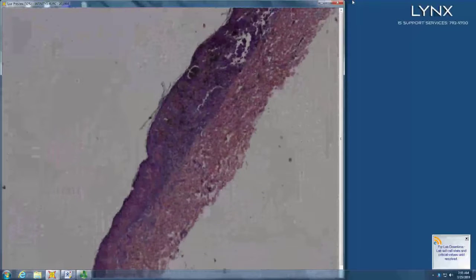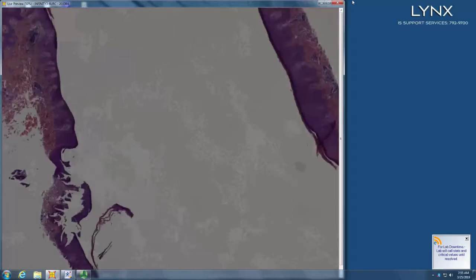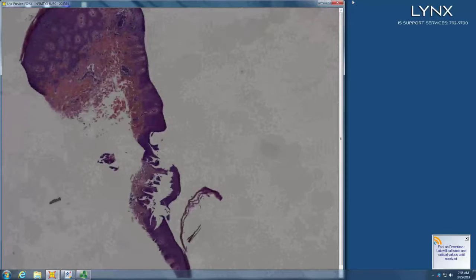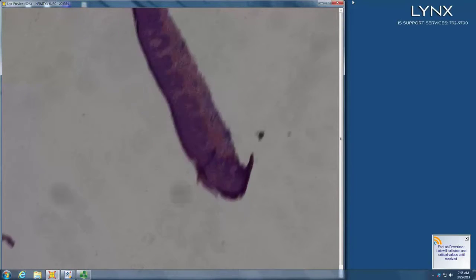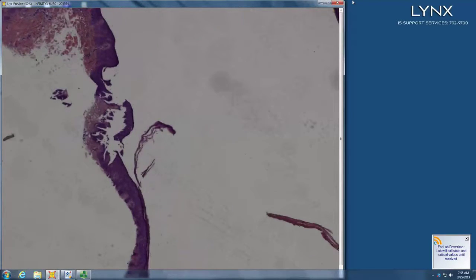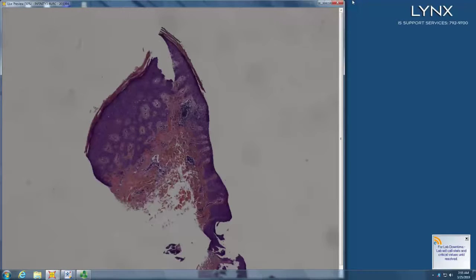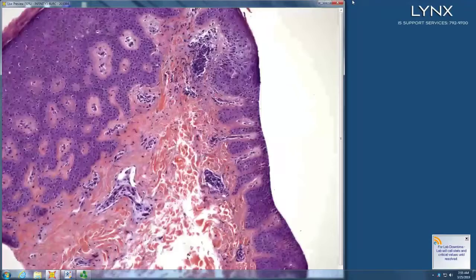This doesn't look good. There's a lot of pigment. So what kind of pigmented thing doesn't look good? I'll accept that. Okay. There's some psoriasiform acanthosis. Yeah. So if you're thinking not a whole lot, then I would say I'm there with you.